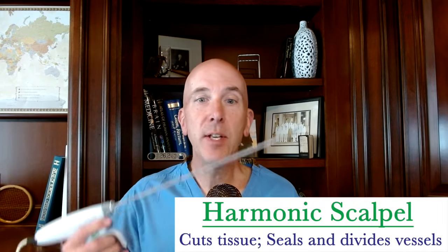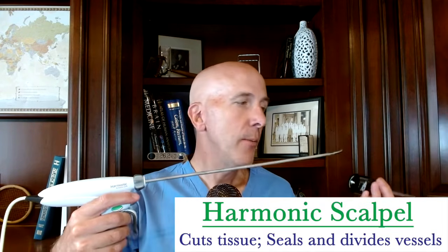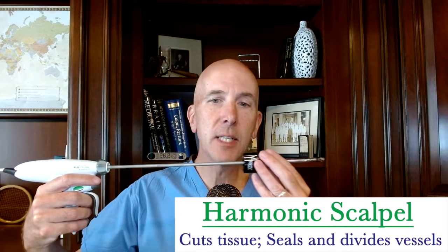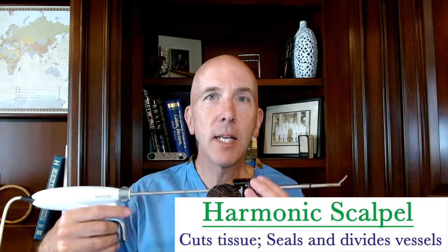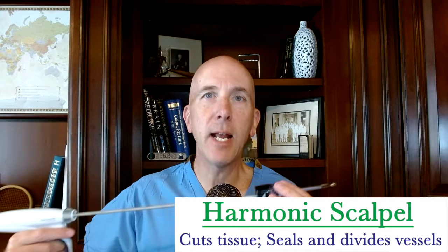Another instrument that's very important is an energy device, and this is what's called the harmonic scalpel. When we take this harmonic scalpel, we can also place this through the trocar, and this allows us to grab vessels, seal them, divide them, and prevent any bleeding as we perform the operation. Very important. It's an amazing instrument. I'm going to talk to you a little bit more about what this does in just a second.